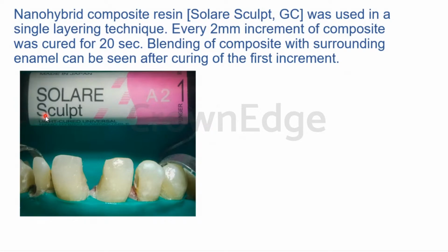One, we don't want it to pool. Second, we want even distribution and the bonding agent to get a little deeper into our tubules. We want a very even distribution across our tooth surface. We do not want lumps of bonding agent here and there. So we want to distribute that evenly and have a uniform layer of bonding agent throughout the restoration, right? So that is the reason why we need to air dry and also to remove the solvent, as I said.